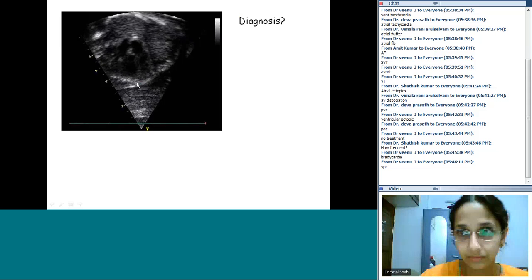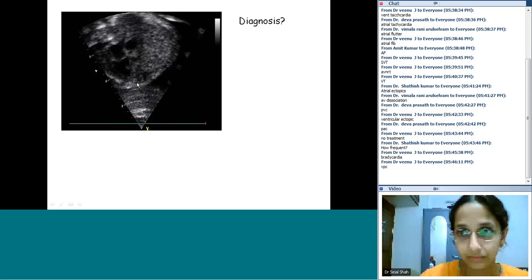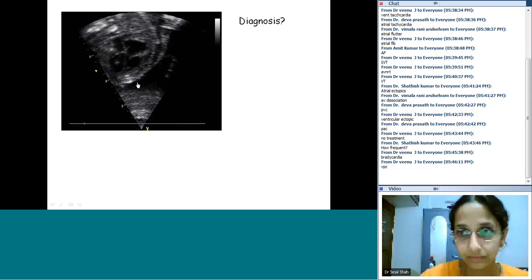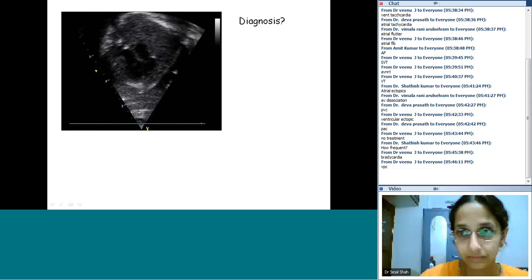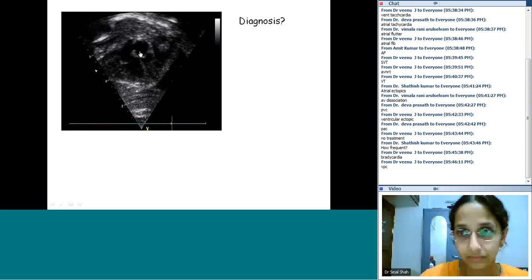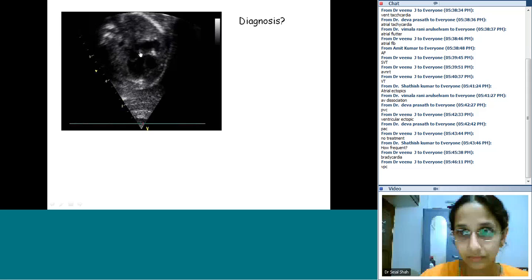As so far we have seen, M-mode and Doppler studies are cornerstones for diagnosing arrhythmias. However, you can also suspect arrhythmias on 2D. Just seeing the 4-chamber view, just getting an understanding of the heart rate, the squeeze of the heart, etc. Anybody? Just in general, does it feel that the heart is beating very fast?